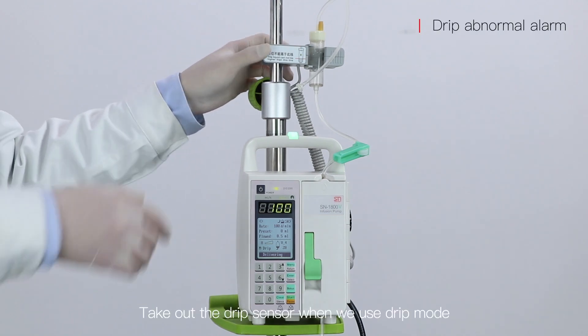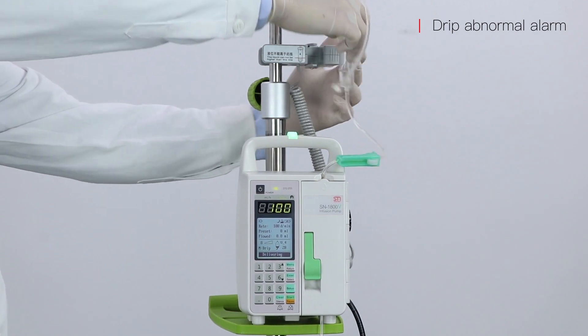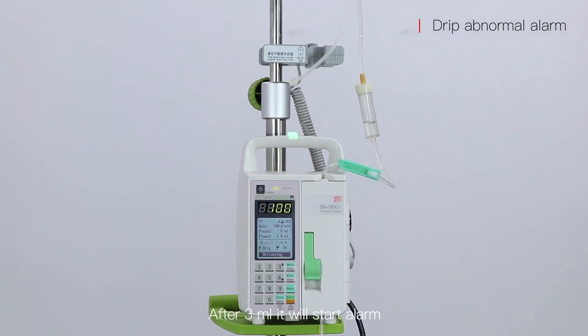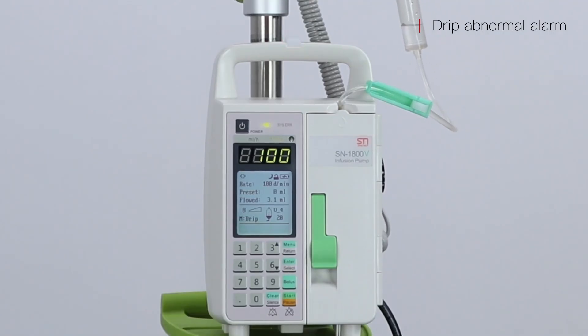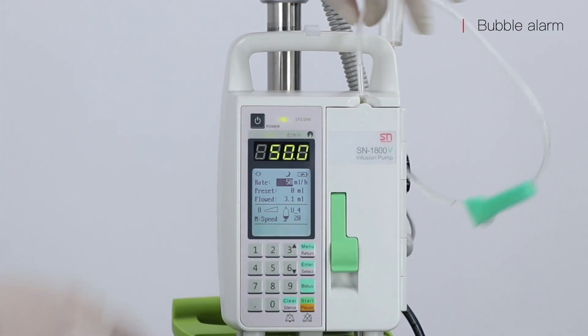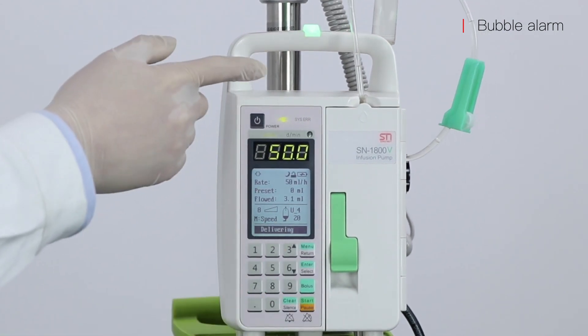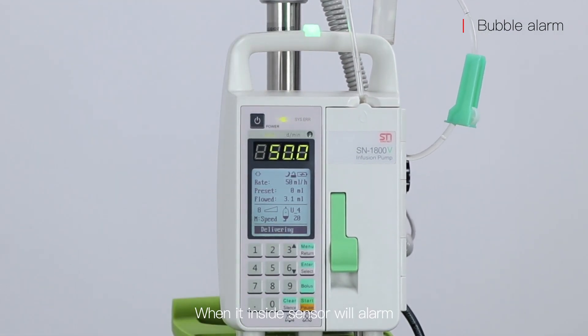Take out the drip sensor when we use the drip mode. After 3ml, it will start an alarm. If we have a bubble, we start. When it's inside the sensor, it will alarm.